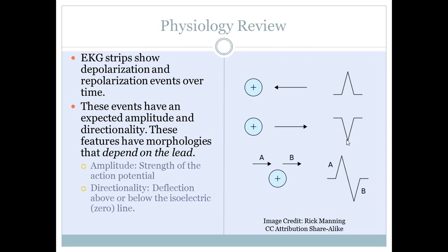This electrical activity is just the depolarization and repolarization that occurs in the cardiac muscle cells as it extends from the cardiac muscle through the surrounding tissues.